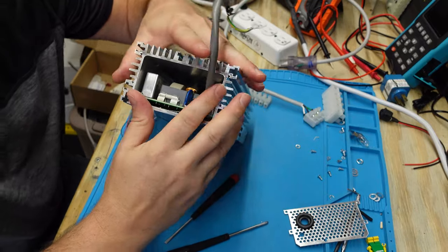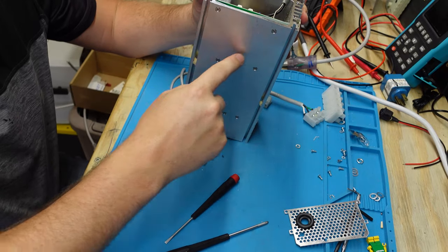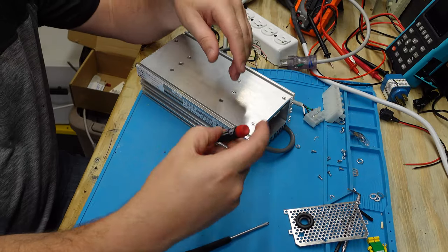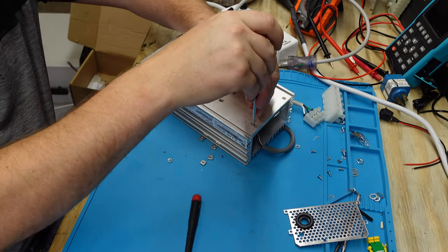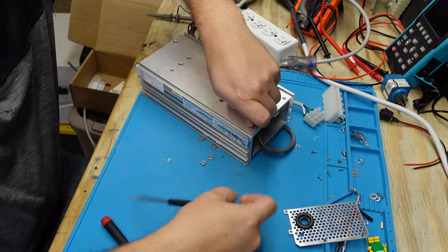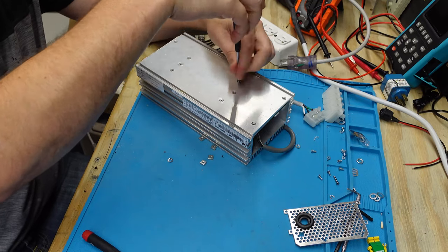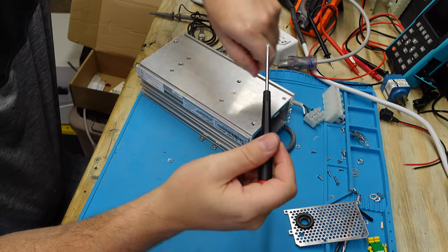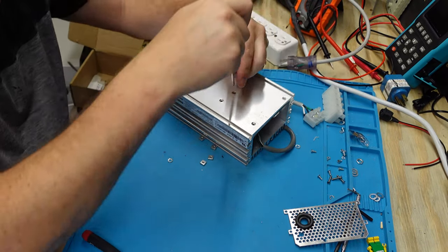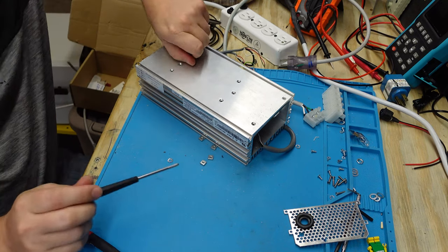All right. So you can see what they did is they just slid the card in and it's affixed with these Phillips head screws on the bottom. So that means the whole card's going to slide out one side. I have to take all these screws out. Which is weird because why use this large of a heatsink if the transistors are not going to be hard affixed to the wall so that they're, you know, coupled for better heat transfer? I don't know. We're going to find out in just a minute. No, I'm not really keeping track on where these fasteners come from. I'm just pulling them all out. Who cares?